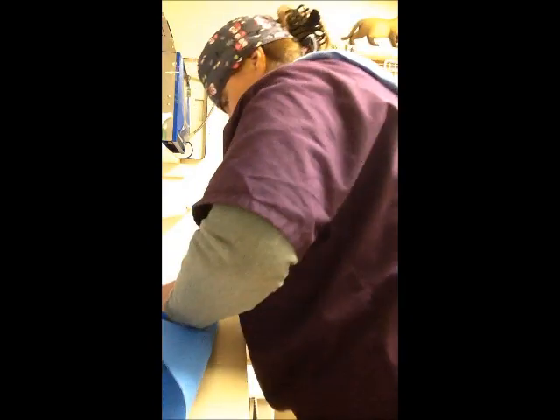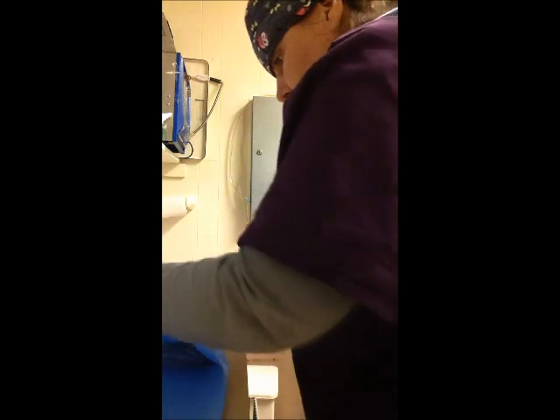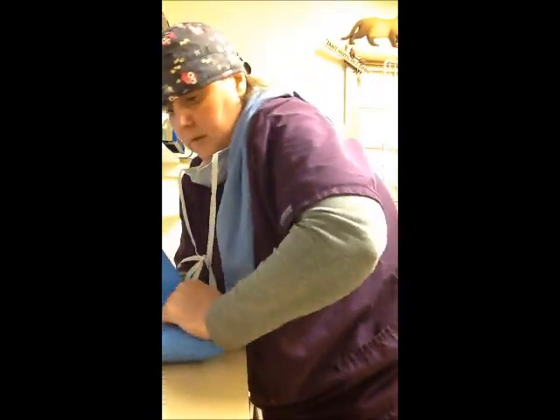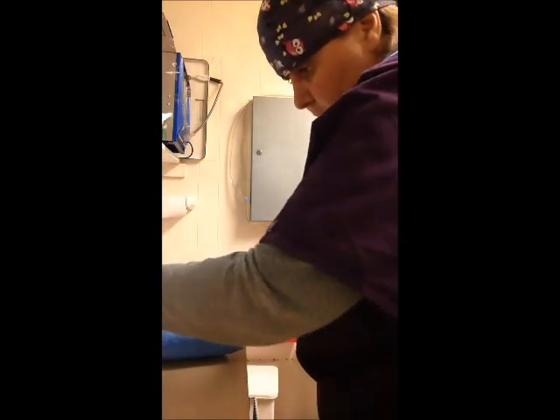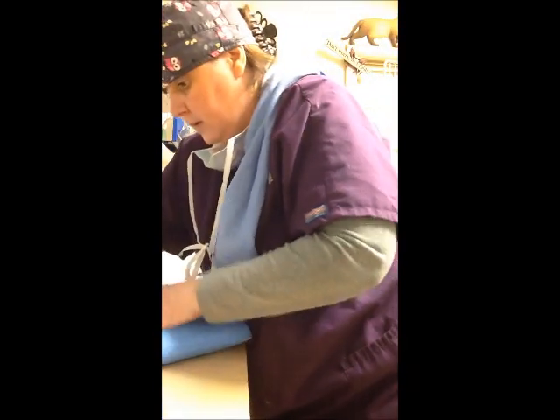All this one. Fold back and forth until you leave the tip revealing, so that you can pull that piece later.